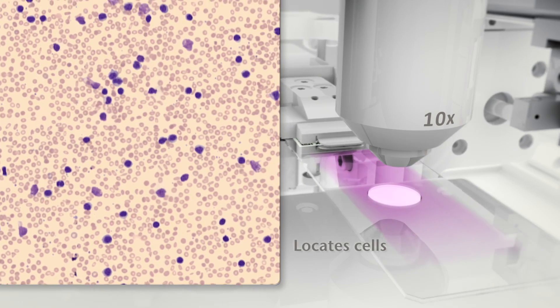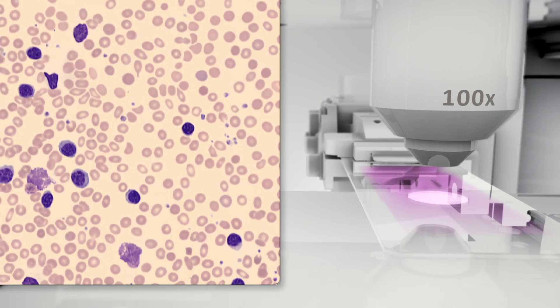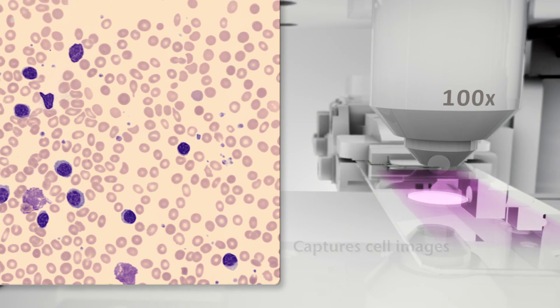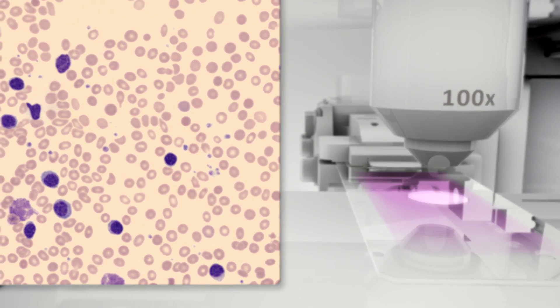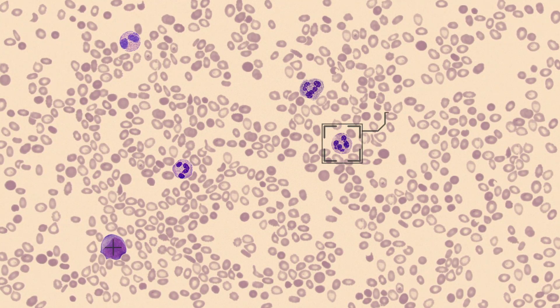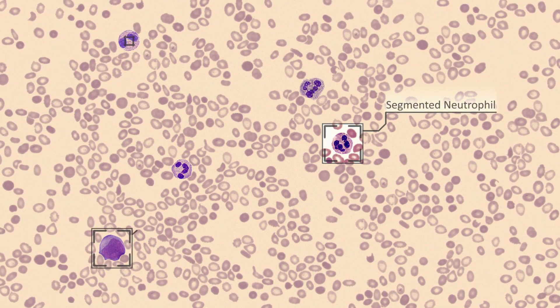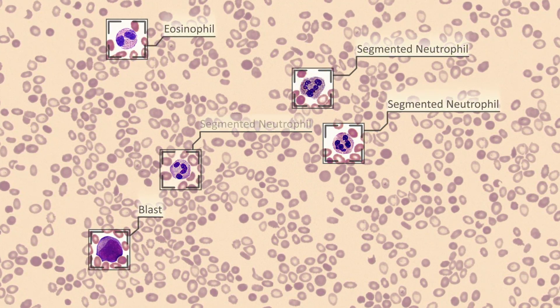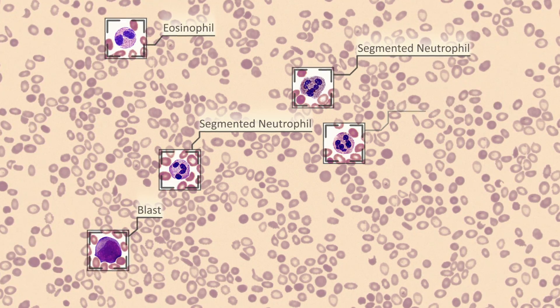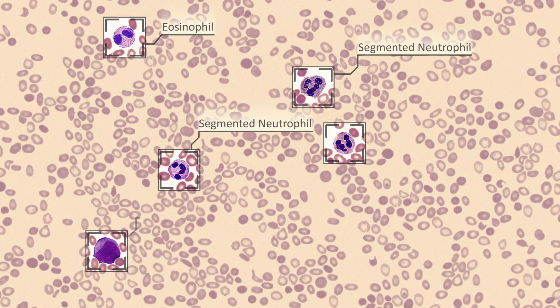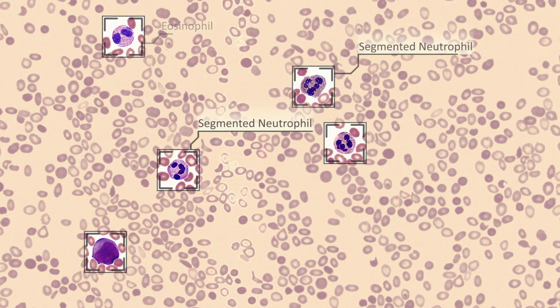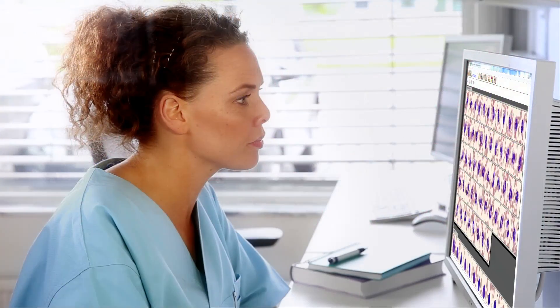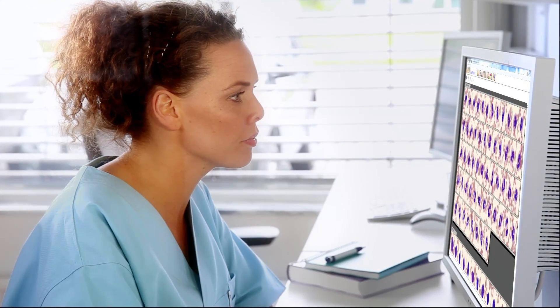Cells are located and high-quality cell images captured. Innovative image analysis technology delivers a pre-classification of white blood cells and a pre-characterization of red blood cell morphology for review and verification by a technologist.